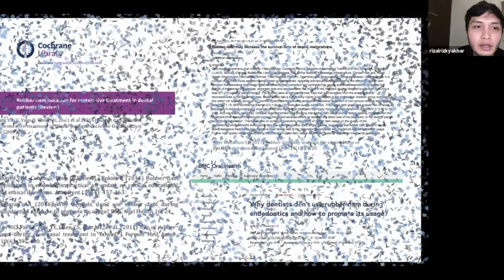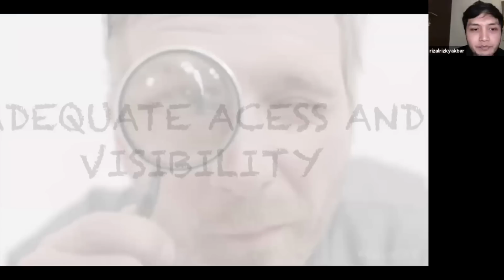Yeah, at least 5 functions. Rubber dam has 5 functions: A, B, C, D, E. You can read by yourself. The first one is adequate access and visibility.